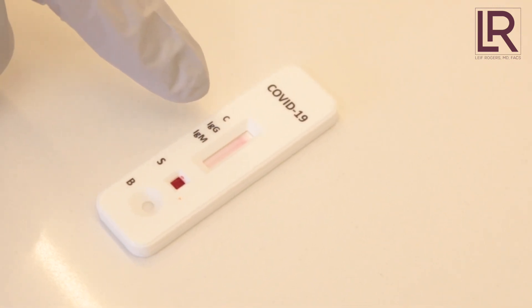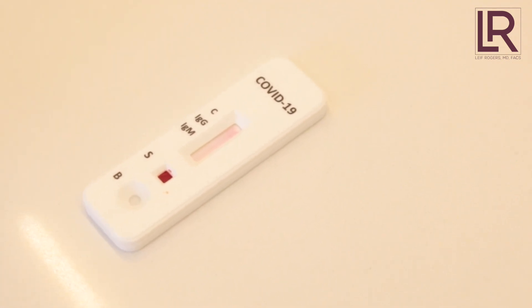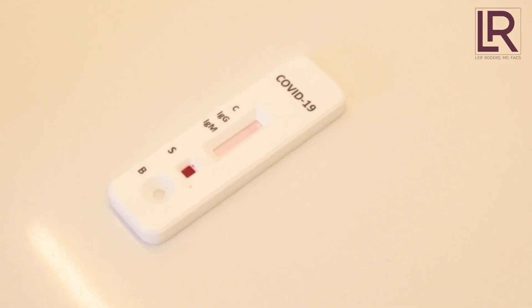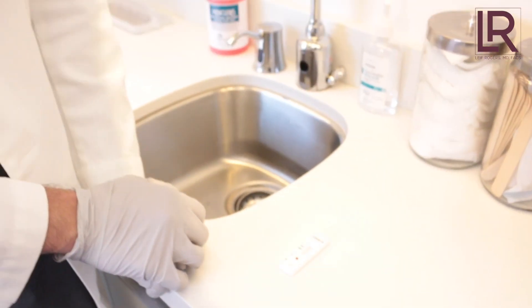You can see that little line forming right at the C — that's for control. That just tells you the test is working. Nick, I'm happy to say you do not have it, and unfortunately you have not had it — you do not have immunity yet either. I'll also post one of a friend of ours who did have it. We wanted to test her to validate these tests and make sure they're actually working. We did it on her even though we knew she had already had it and gotten over it. I'll show you that test too — it's very obvious what a positive looks like.